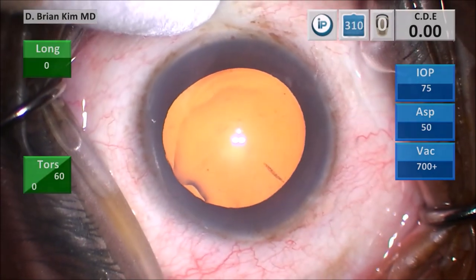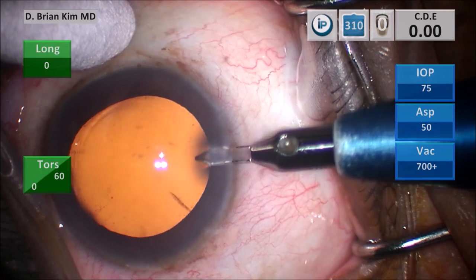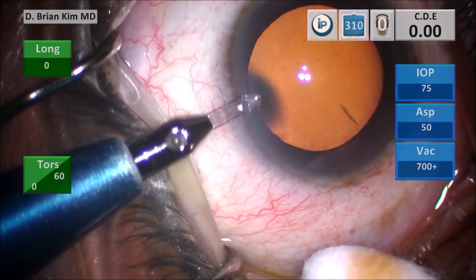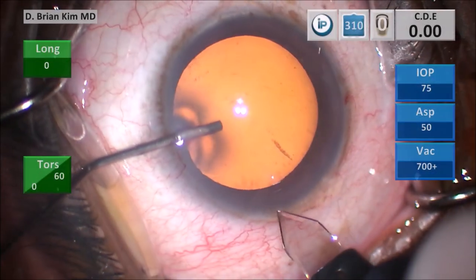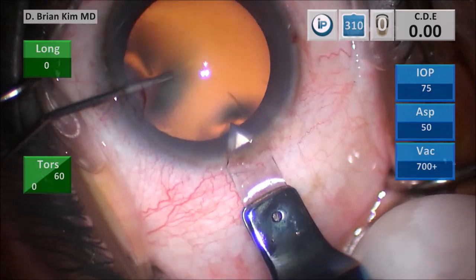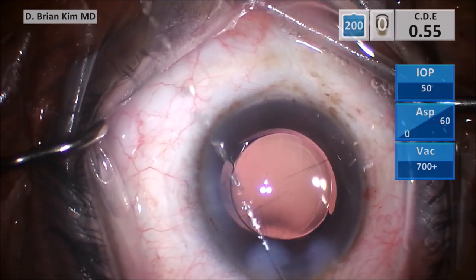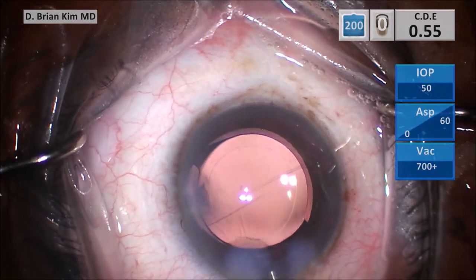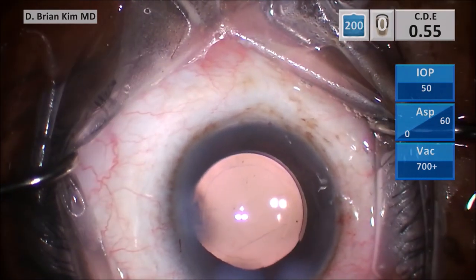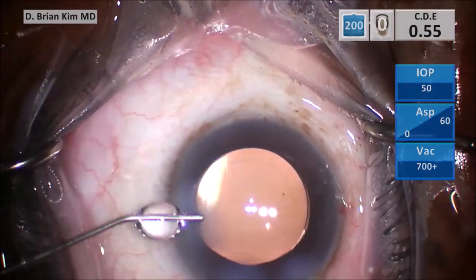Here's another case. After marking the cornea, use a cotton tip to pull the eye to the left — make your paracentesis incision flat and parallel to the iris plane for a nice rectangular incision. Perform the same procedure on the other side with the aid of a cotton tip. Place viscoelastic with the cannula, make a vertical groove, tunnel through the deepest part of the groove, and then enter into the eye. Hydrate the left and right parts of the incision, then hydrate the roof by sweeping side to side very gently with some pressure so that you see stromal hydration and whitening, but not such pressure that you cause potential Descemet's detachment.